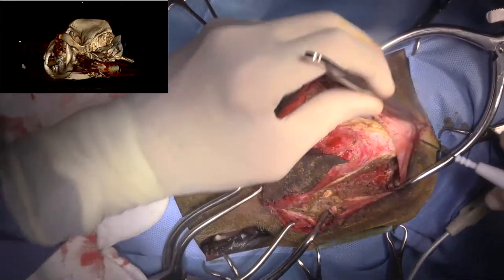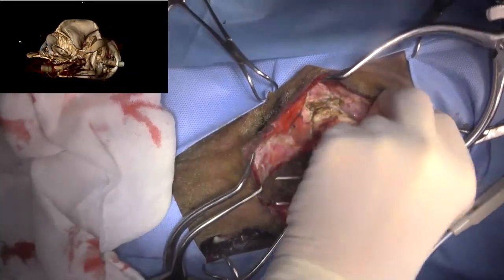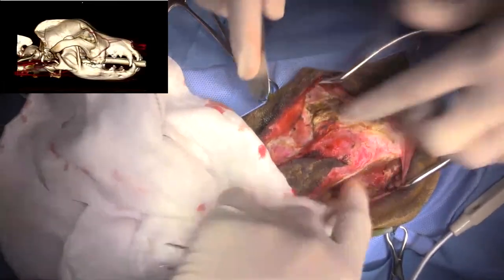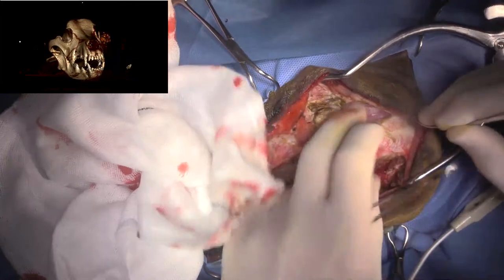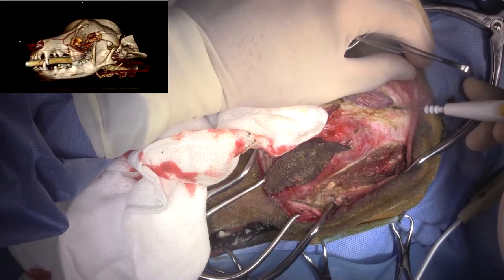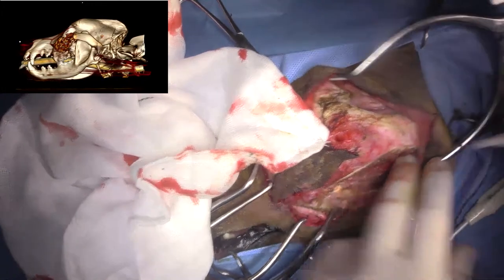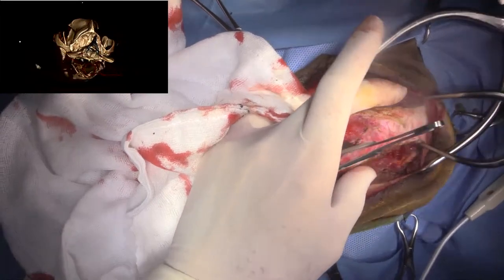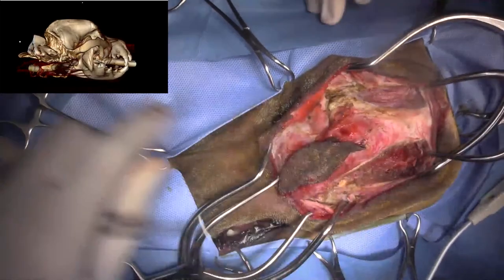Yeah. I think. Let's see here, just try to dissect back a little bit further here. So we've got the zygomatic arch exposed there nicely. All right, so I might go ahead and cut through that. Let's get a couple of Homans in there. Dissect a little bit further caudally. And we'll get a little bit farther back here as well. Just get Jeff to retract that caudally so you can see the zygomatic arch right here. And then.